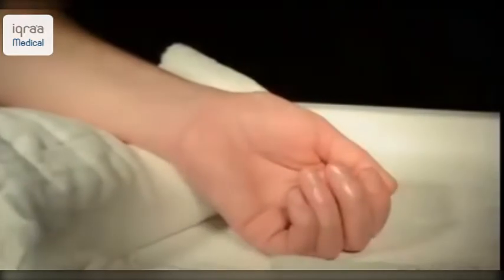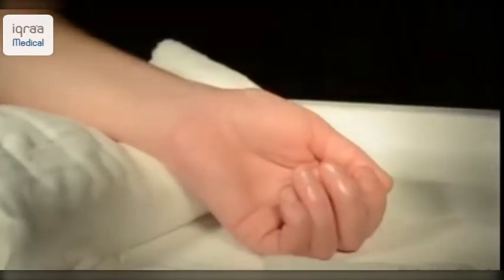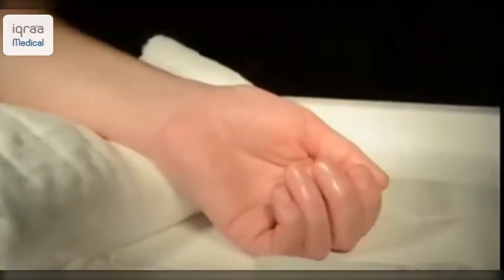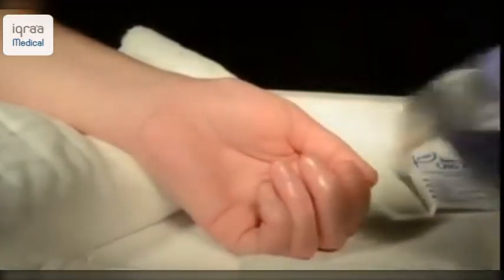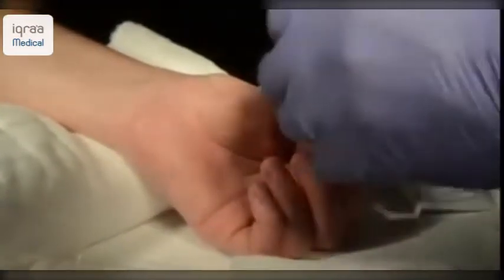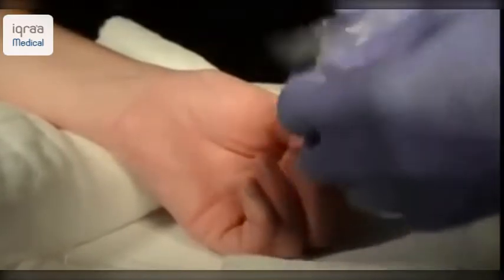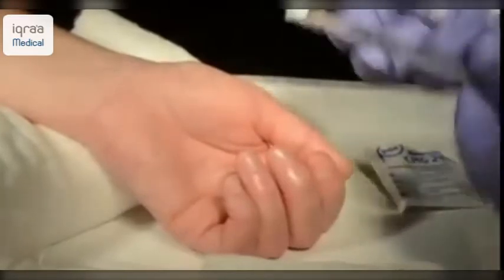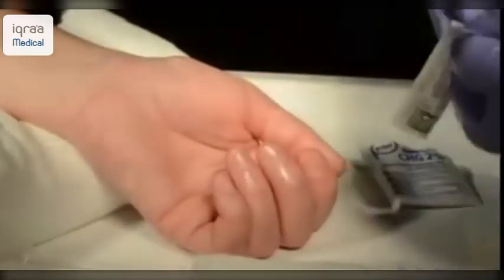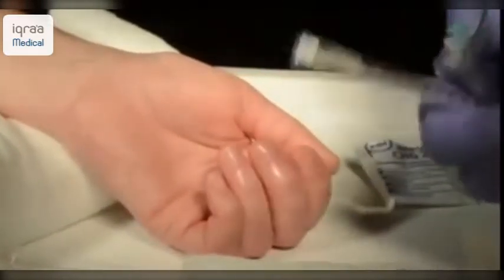Prepare your equipment and make sure everything is at hand. Ensure you're wearing universal precautions and that you have decontaminated your hands thoroughly. For this procedure you're going to need a heparinised ABG syringe, gauze and alcohol wipe, and a 21 gauge needle.